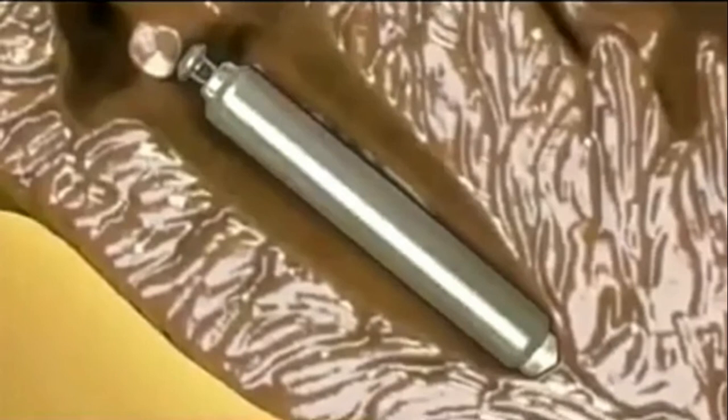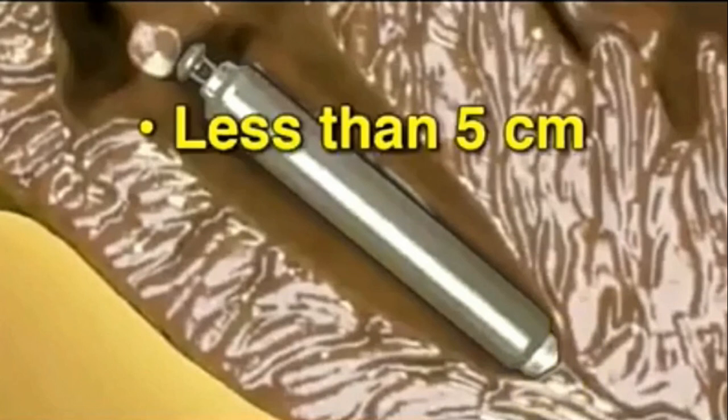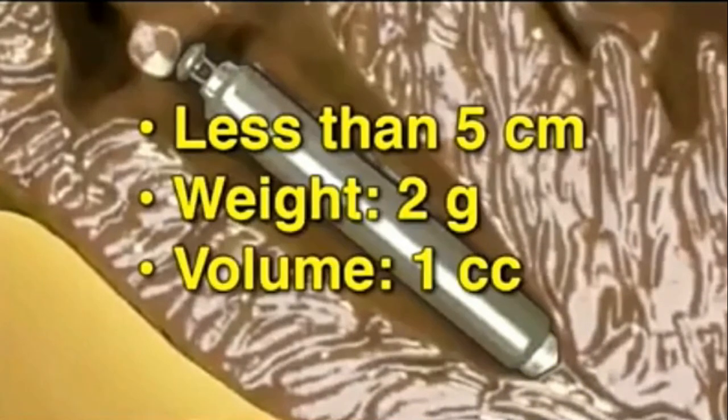The leadless cardiac pacemaker is a pacemaker that senses and paces like a conventional pacemaker, but it has no electrical leads, and it is implanted directly into the right ventricle without surgery by a catheter-based approach. The device is less than 5 centimeters long, weighs 2 grams, and has a volume of 1 cubic centimeter.